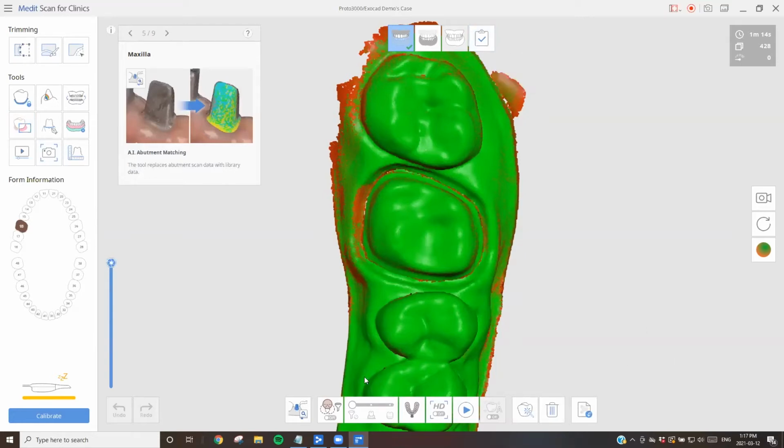So if I leave this function here, and I'm just going to quickly go over some of the tabs on the bottom. So you have a scan body finder. So for your implant restorations, you can log this for your lab. This is something you can also do in Exocad. But if you want to take some of the guesswork away, you don't want to type the name out of the implant company, the component, the number, then you can do it all here.